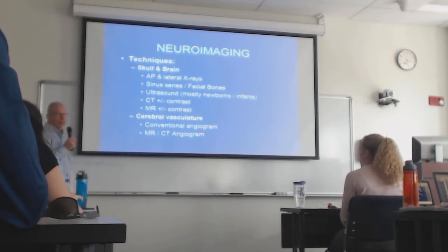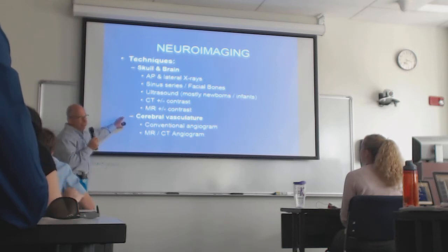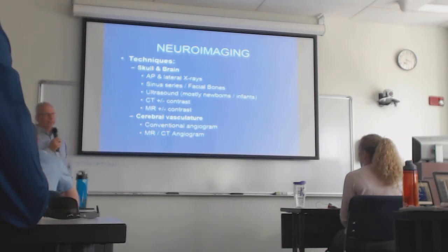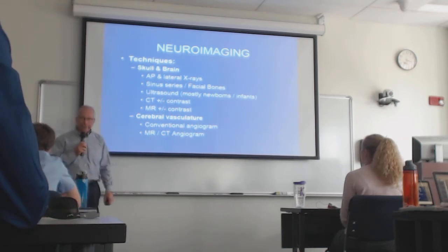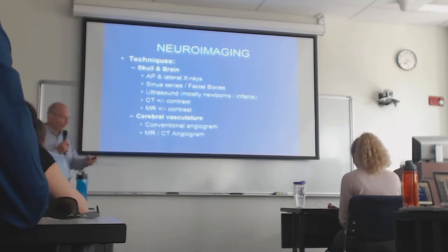And we use that all the time to look for early bleeding in the brain of a premature infant, for the most part. Of course, CT and MR are spectacular for the neuraxis, for the brain and the spine, whether without intravenous contrast or with intravenous contrast, and I'll show you some of that stuff. And then, of course, we have some very special ways to look at the blood vessels of the brain, the blood vessels that feed the brain, the carotids and the vertebral arteries, and then the blood vessels in the brain itself.